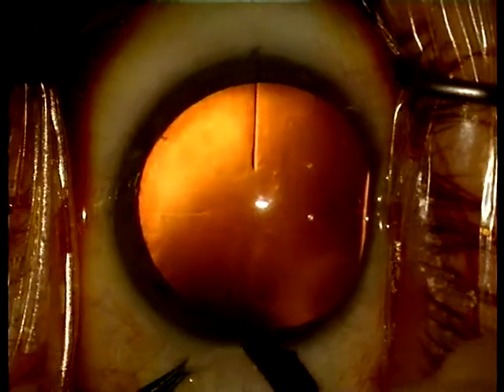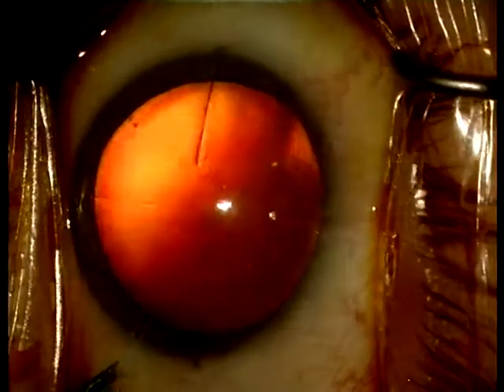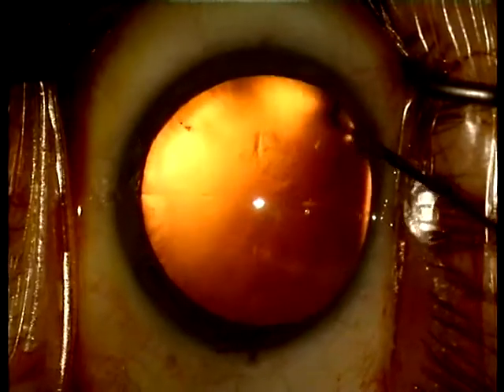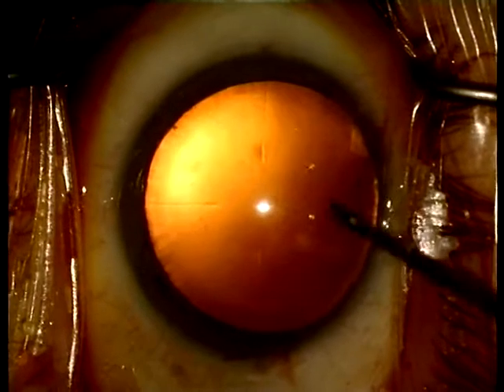To create a watertight three-step incision, first a 600 micron groove is performed. A single paracentesis is placed nearby the location of the distal haptics. Preservative-free lidocaine is injected into the anterior chamber followed by methylcellulose.